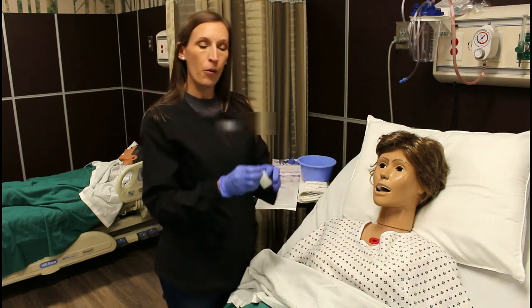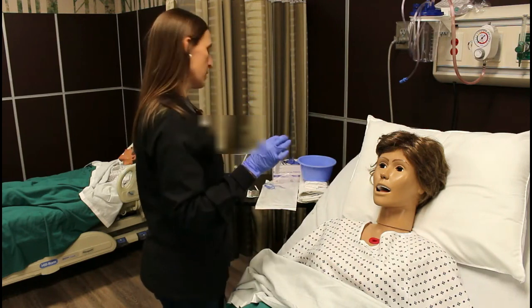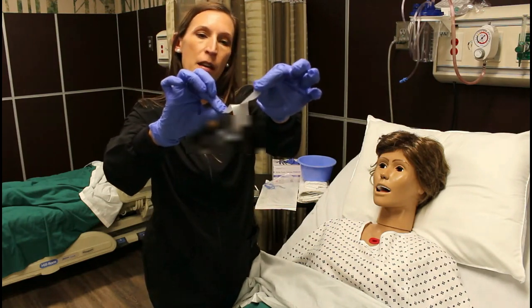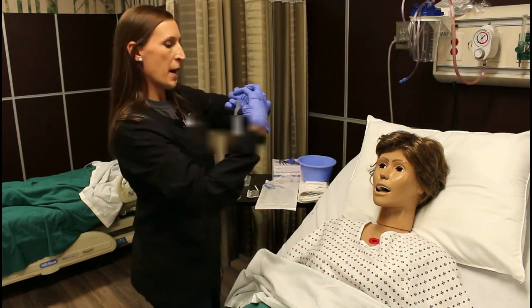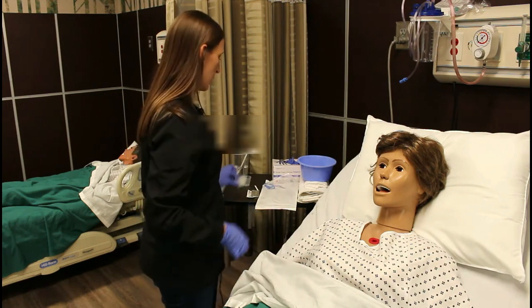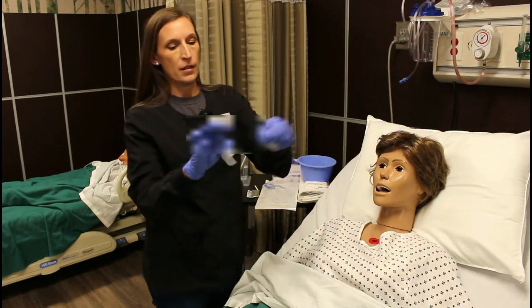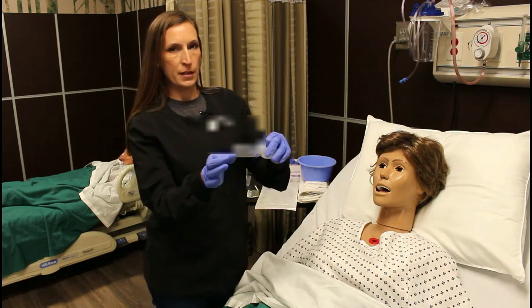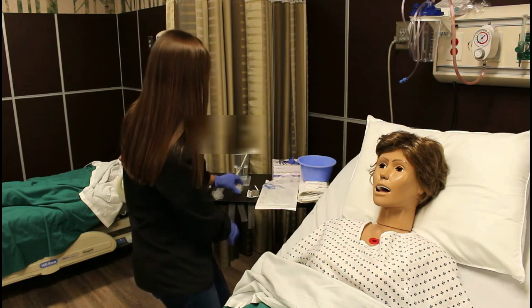I'm going to tear my tape now. You want about four to five inches. Tear it down like this and leave about an inch at the bottom — that's called a bifurcation. We bifurcated our tape, and we're going to tape it right here where I can get to it easily. Tear one more piece about three inches long and put that right next to it. One more piece to help secure the tube afterwards, and we have all of our tape torn.